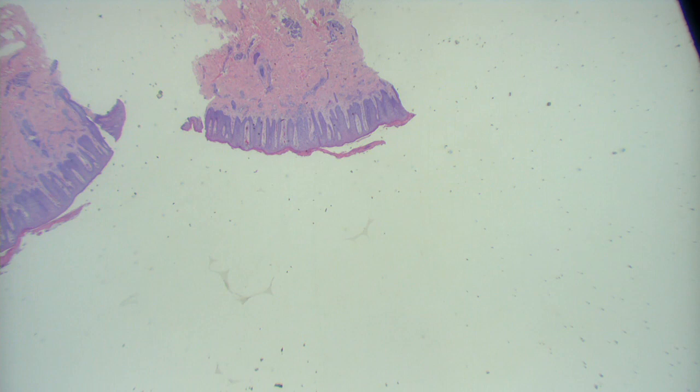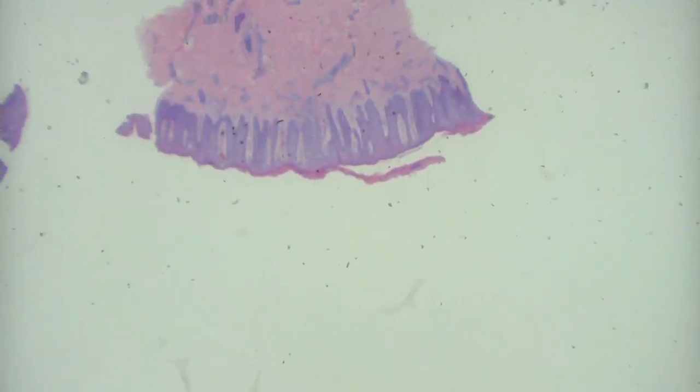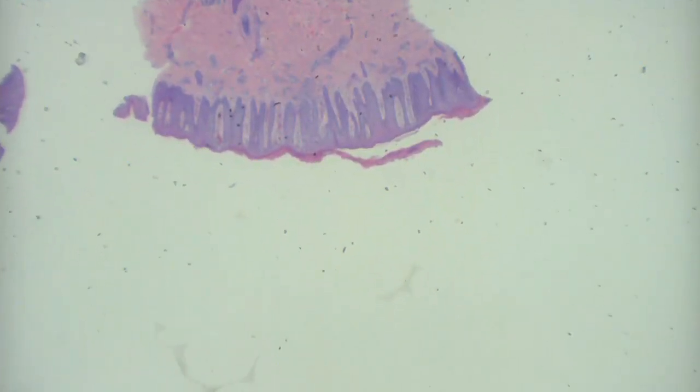Okay, who wants to give this one a go? Alright, so you've got a punch biopsy. The epidermis looks acanthotic, pretty regular. Yes, very regular.